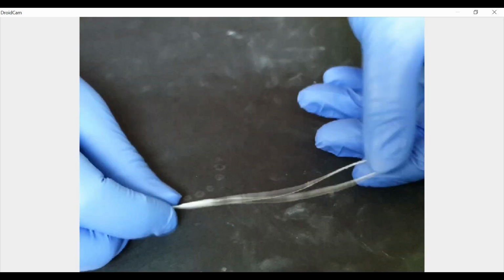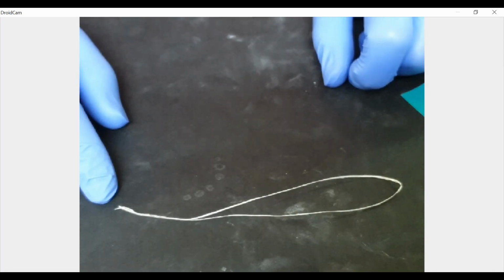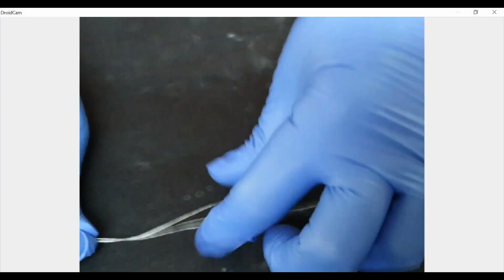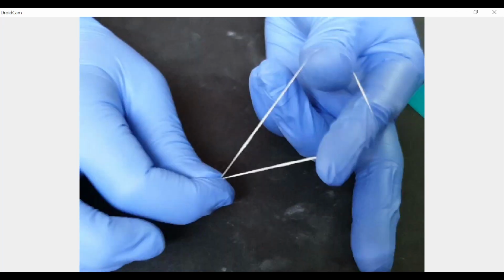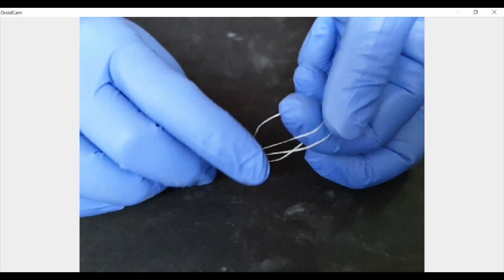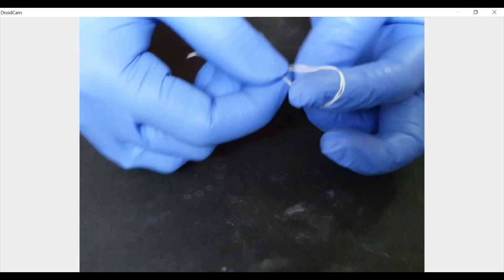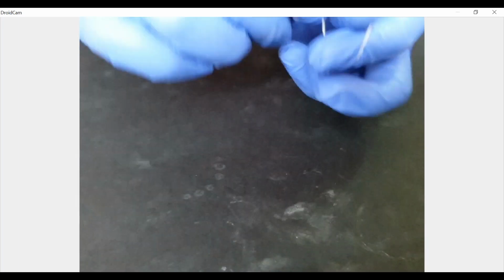Okay, so I have taken a certain length. You can take a longer length of the dental floss when you're doing it the first time. Oppose the two ends together and take the looped end, engage your fingers in this and have a small triangle formed between the fingers. Now upturn the finger and engage only a single finger through all the holes and get the initial knot.